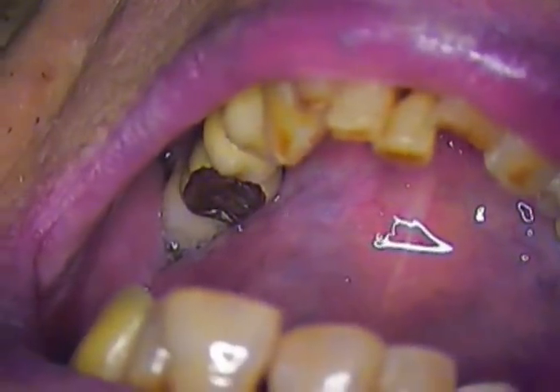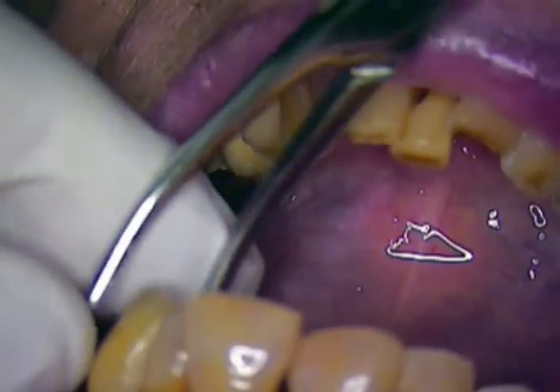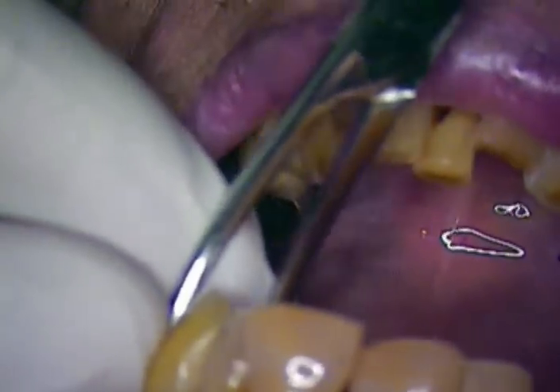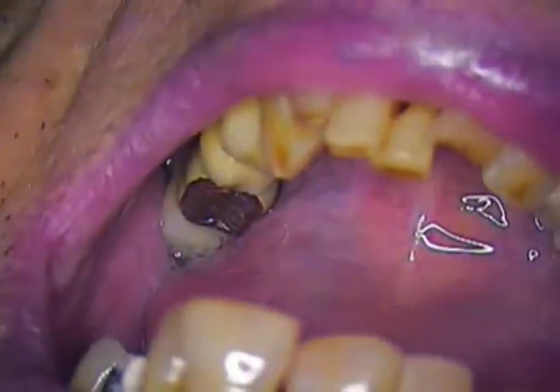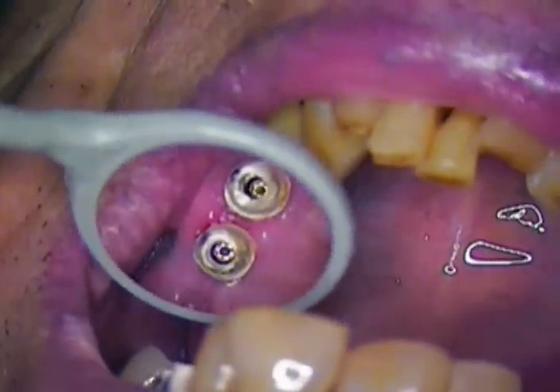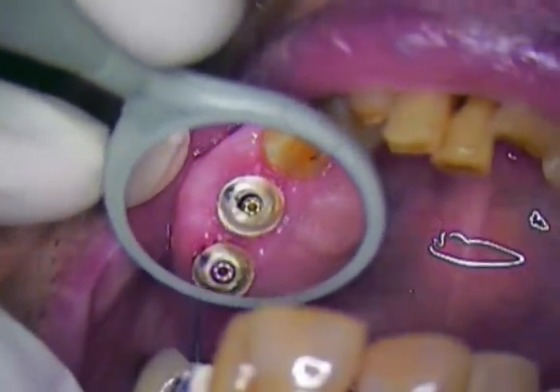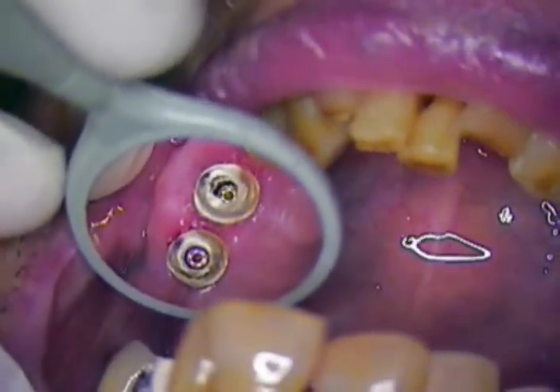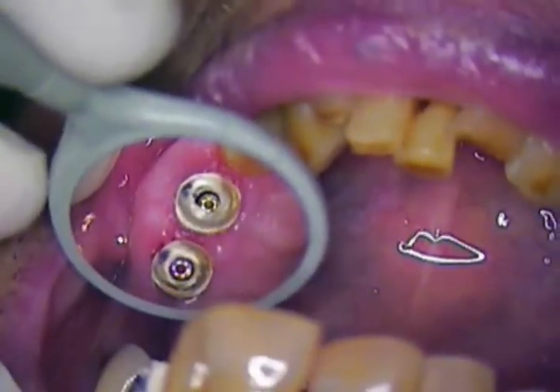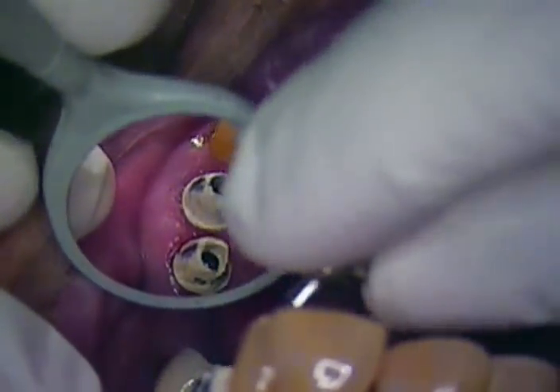I'm now removing the temporary for this bone level case and then we're going to take a look directly at the temporary peak abutments. There are a lot of companies out there that don't have as well-defined peak abutments as the Straumann system. It seems like they're missing the boat when it comes to controlling the tissue health. I want to describe some of those issues as I remove now these peak abutments.